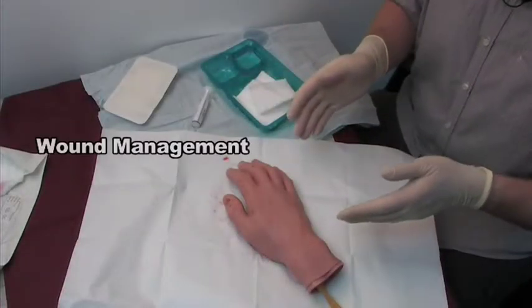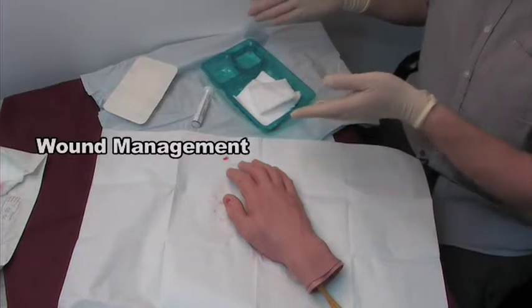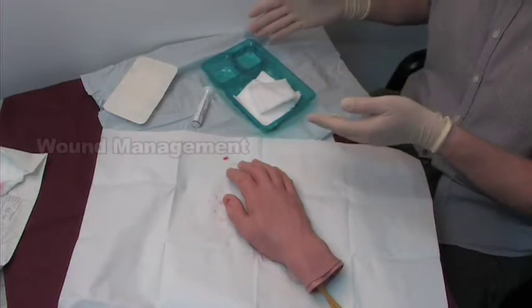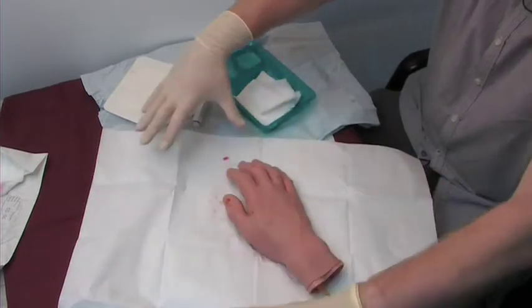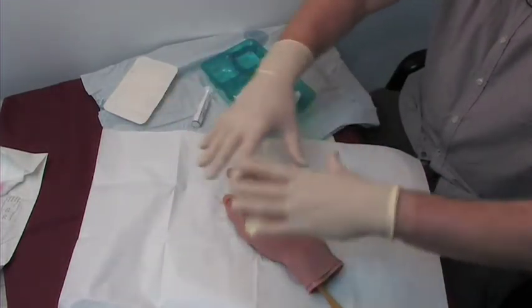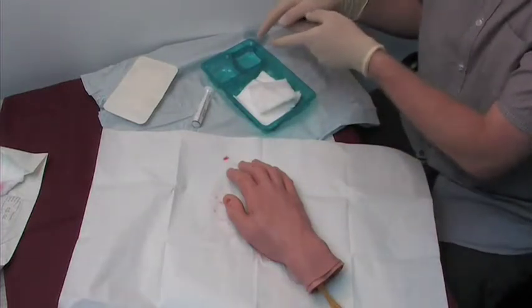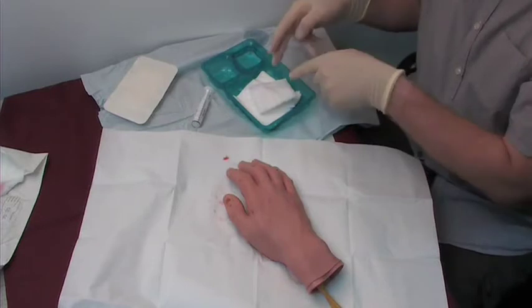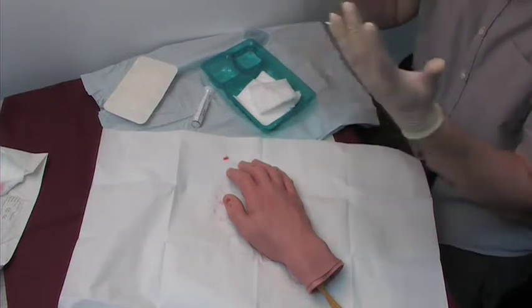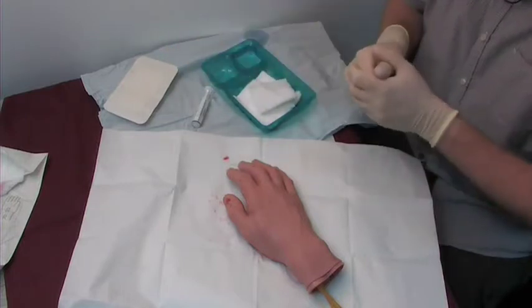So we're just going to demonstrate wound management. We have our dressing pack which has been opened up using the sterile technique which was demonstrated before. Opened up, we've got a drape — the patient's hand is placed over it. This is my sterile field. I've got my cleaning solution which is normal saline, my gauze swabs from the dressing pack, wearing my sterile gloves, and I have my dressing to be applied afterwards.